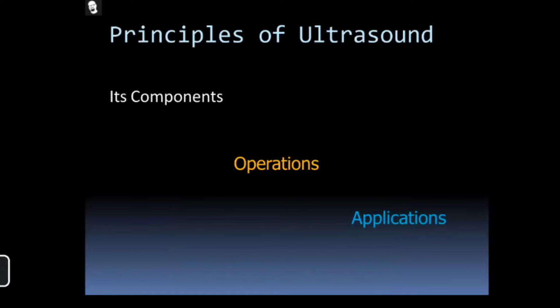Actually, this ultrasound is not producing any radiations, but even though, we always say it comes under radiological equipment. The reason is that equipment used for imaging for diagnosis purposes mostly comes under radiology, so we keep ultrasound in radiology. Let me take the example of MRI. MRI does not produce any radiations either, but we keep it in the radiological department only. Like MRI, ultrasound does not produce any kind of radiations, yet we can fit the ultrasound machine into radiological equipment.